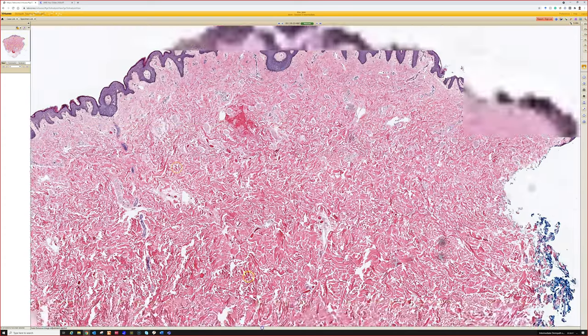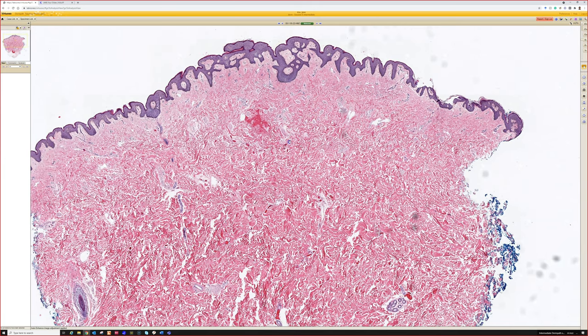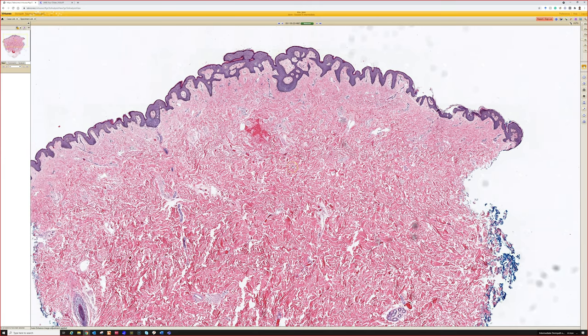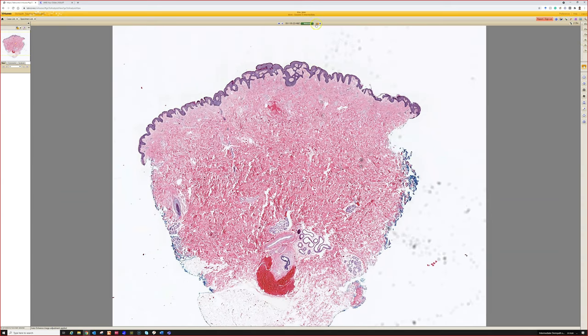All right. And sometimes also you'll see enlarged sebaceous glands up here, which correspond to the Montgomery tubercles, the enlarged sebaceous glands that you see around the normal nipple, accessory nipple, or supernumerary nipple, if you like.